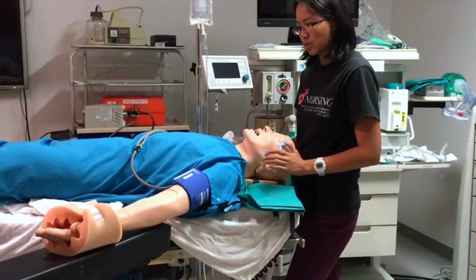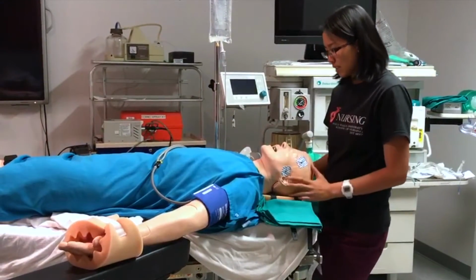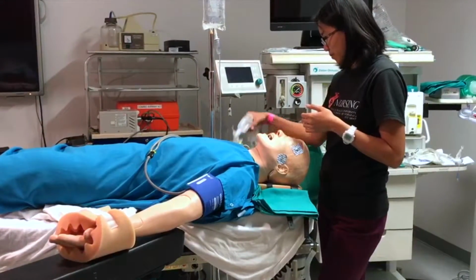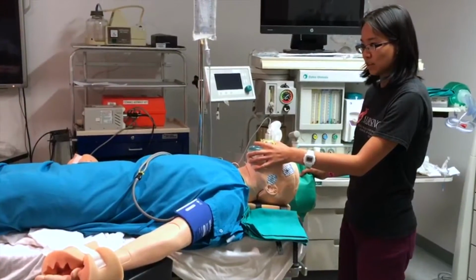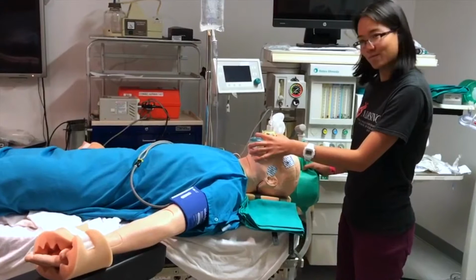The arms of the patient should be supported, or at least on arm boards like this, so that's perfect. And then for me as an anesthetist, I want to be at the head of the bed facing the patient. You also want your left hand to be on the mask and your right hand will be on the bag. This is kind of the standard position that you'll be in for the case. So that's it.